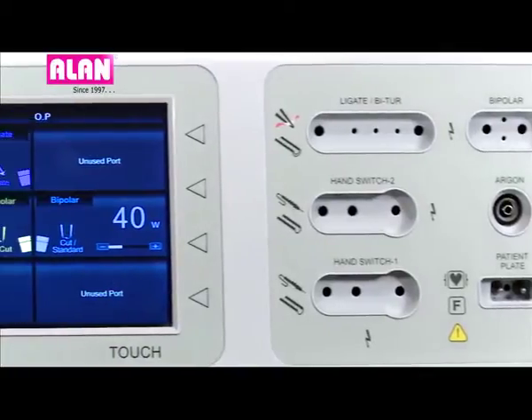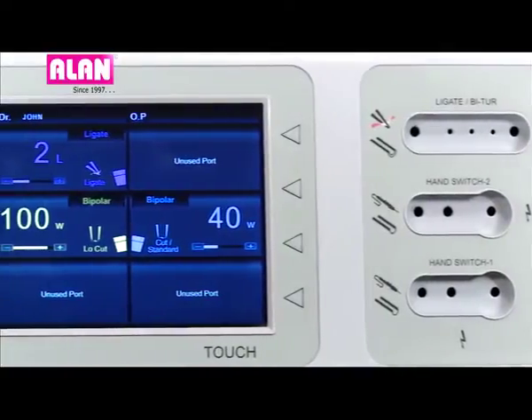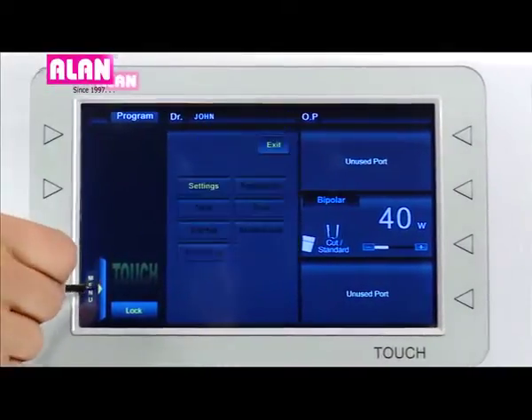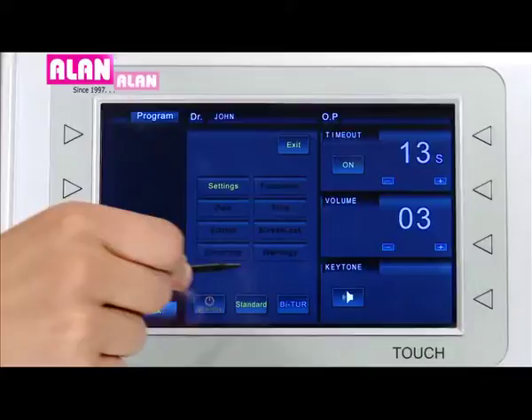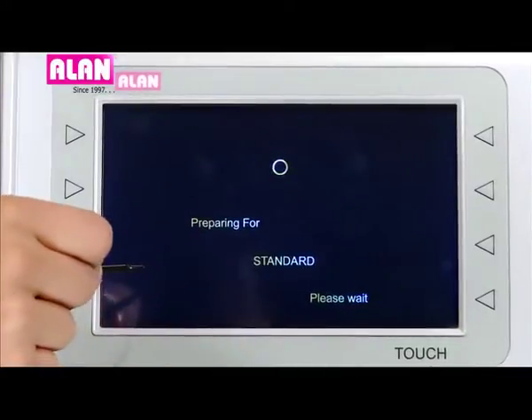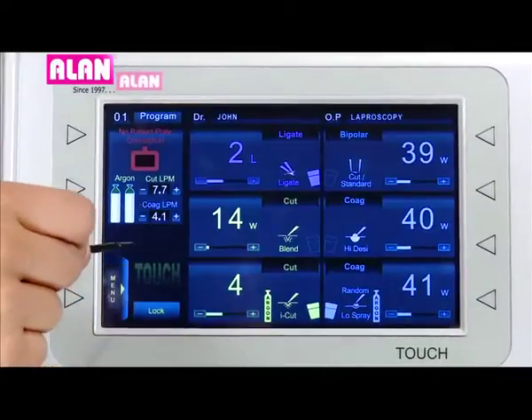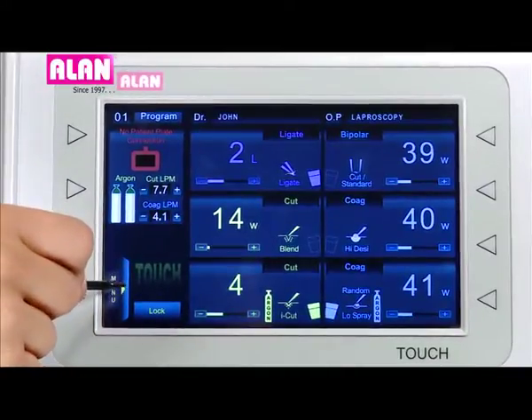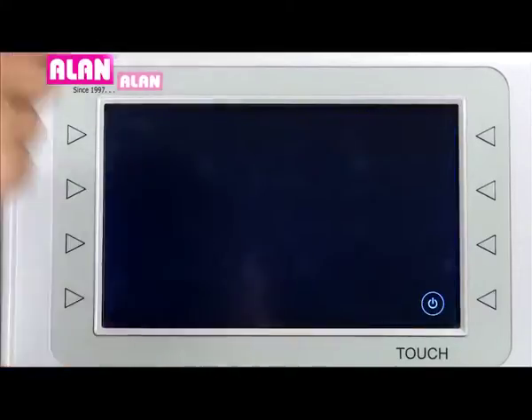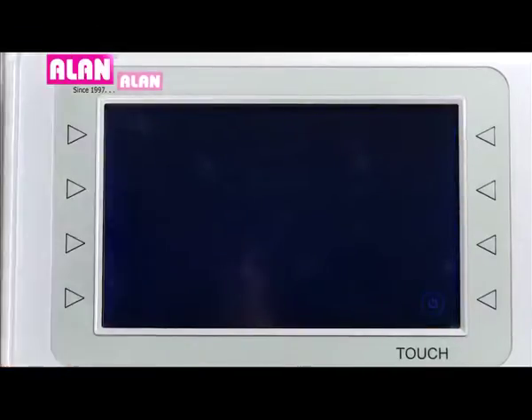To put the unit back into standard mode, touch the menu and then the standard icon. In the menu, a standby icon is provided to put the unit into standby mode.